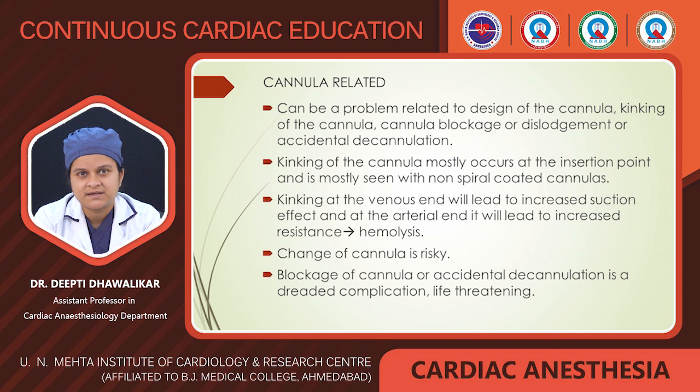Cannula related problems. There can be a problem related to design of the cannula, kinking of the cannula at the insertion site, cannula blockage or dislodgement or accidental decannulation. Kinking of the cannula mostly occurs at the insertion point and is mostly seen with non-spiral coated cannulas. Kinking at the venous end will lead to increased suction effect, and at the arterial end it will lead to increased resistance, which ultimately will give rise to hemolysis.